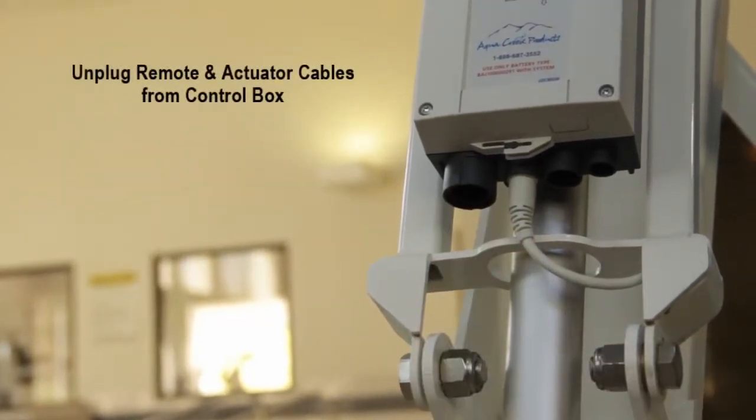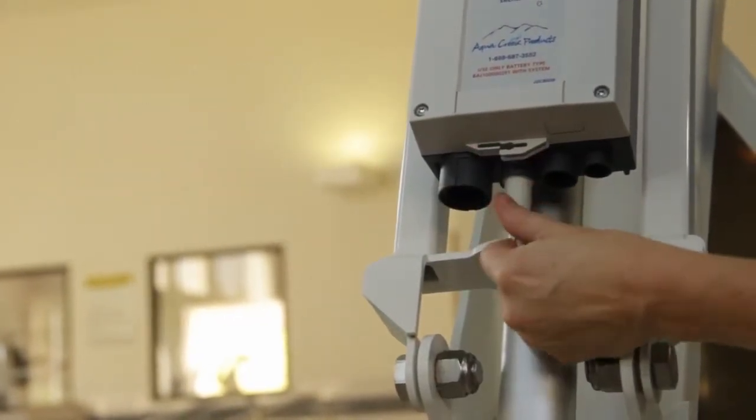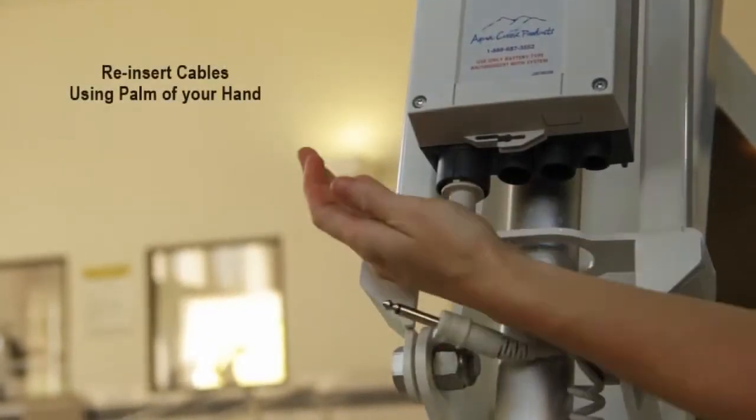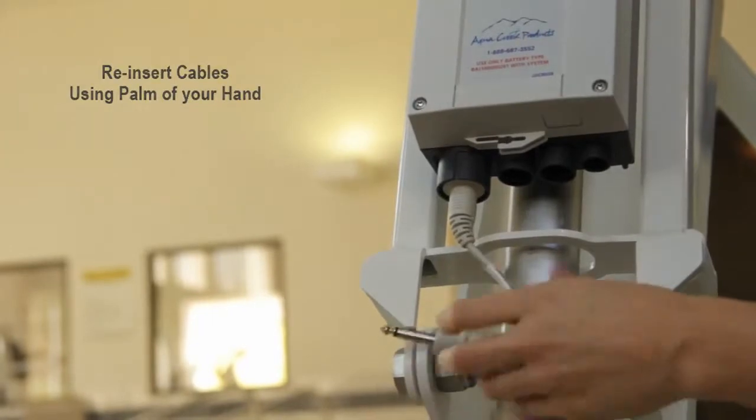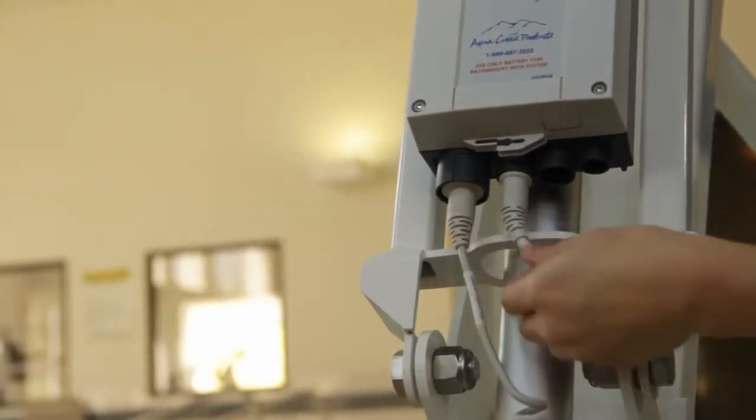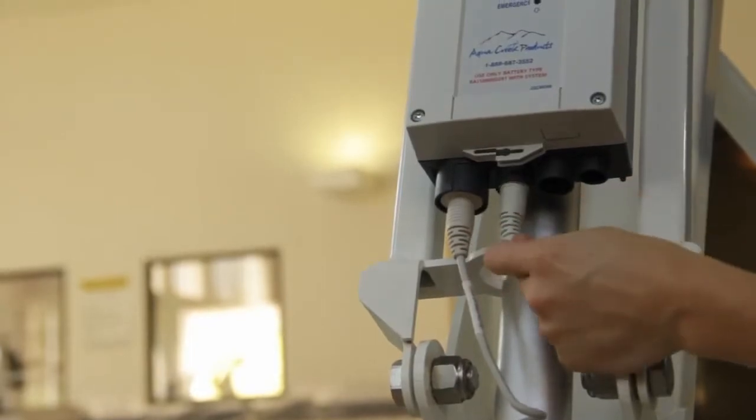Unplug the handset cable and actuator cable from the control box. Reinsert the cables into the control box using the palm of your hand. These are watertight connections and can be stubborn. Now, try operating your lift.